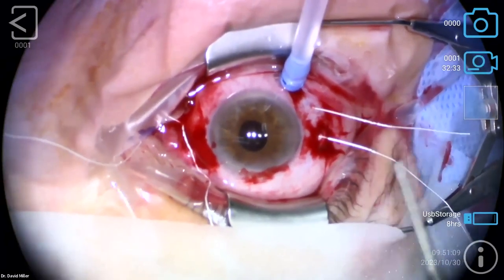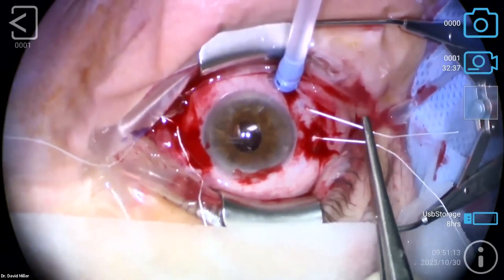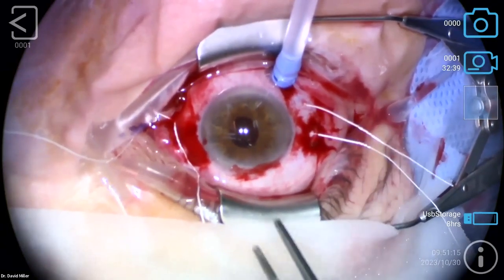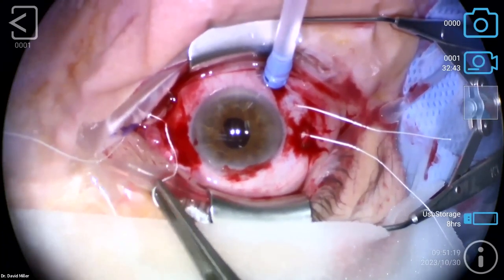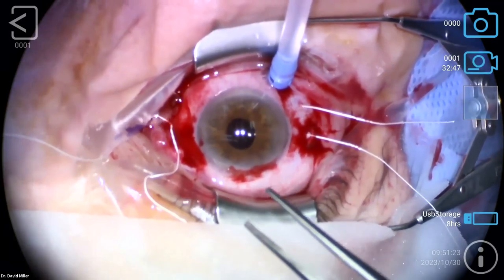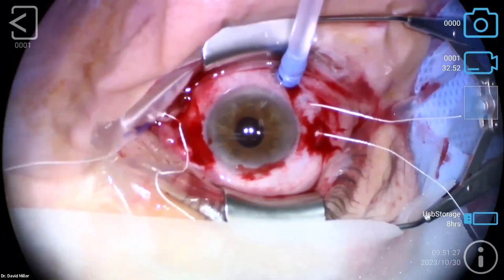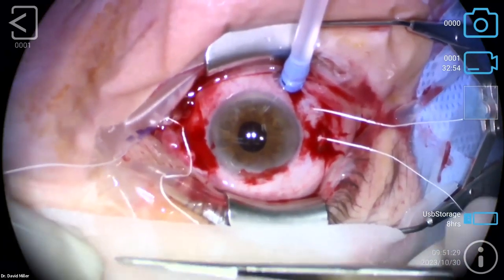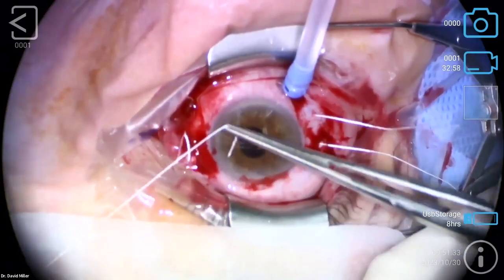I like to leave these loose, if anything, not tight, because you don't want to put stress on the optic. If you put stress on the optic, you get all kinds of optical aberrations and nobody's happy. So you want the lens to be suspended, not tied. Again, these are all things we learned as we went.